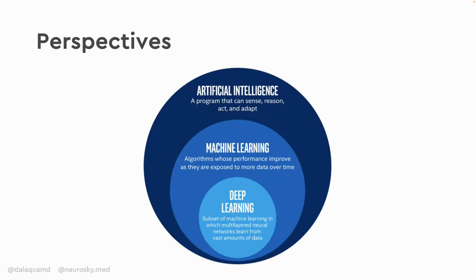So what are the perspectives? So as I said, a simpler approach may exclude fewer patients from treatment, may improve the outcomes, and we should think about the use of artificial intelligence and the help that machine learning and deep learning can provide us in the fast interpretation of our data.